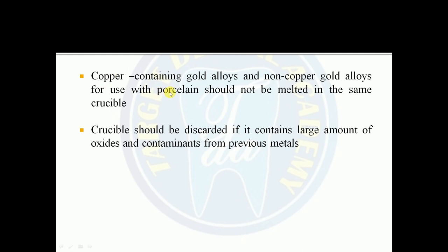Copper containing gold alloys and non-copper gold alloys for use with porcelain should not be melted in the same crucible. A crucible should be discarded if it contains a large amount of oxides and contaminants from previous metal.